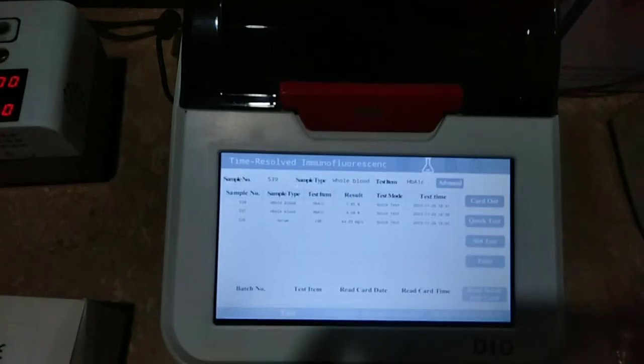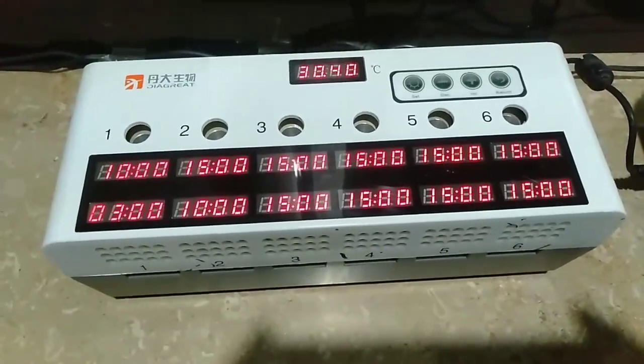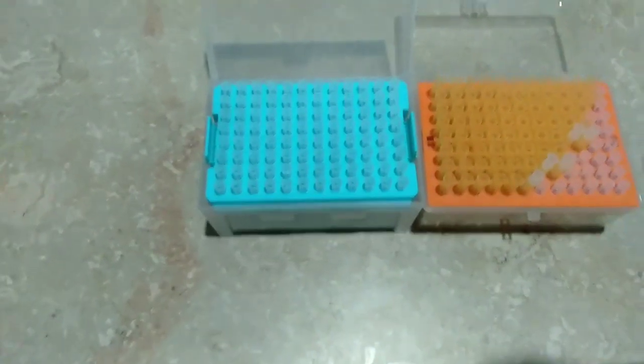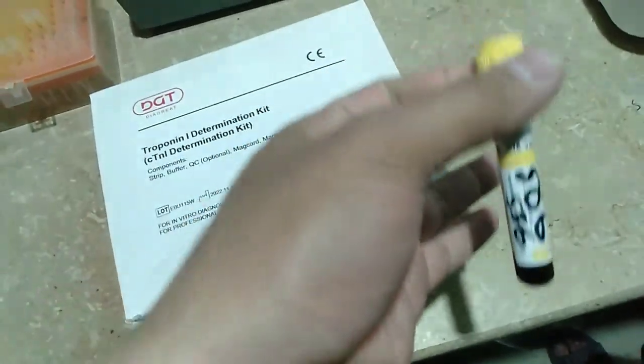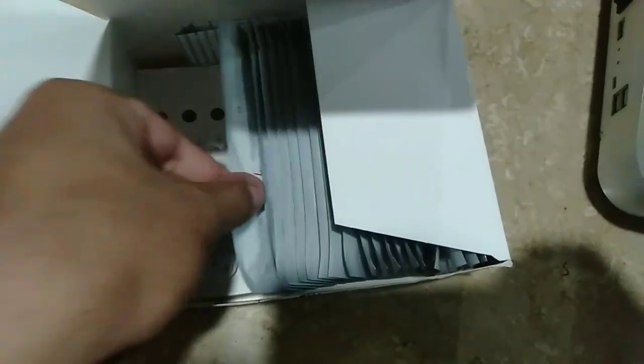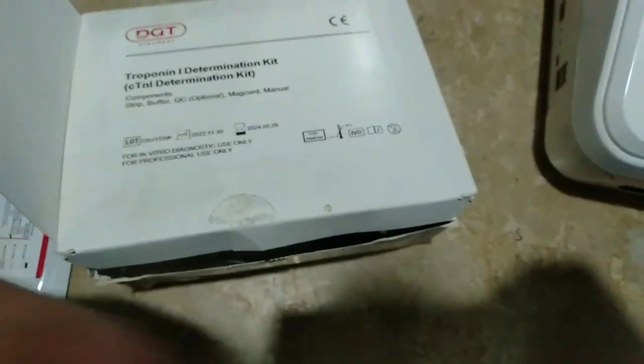Now let's see what we require while performing this test. In this test we need a Digrate machine, as you can see — Digrate incubator, pipette tips, yellow and white tips, patient blood in the gel tube, and a troponin kit. Remember, this troponin kit contains a troponin cassette or troponin strip, as you can see.